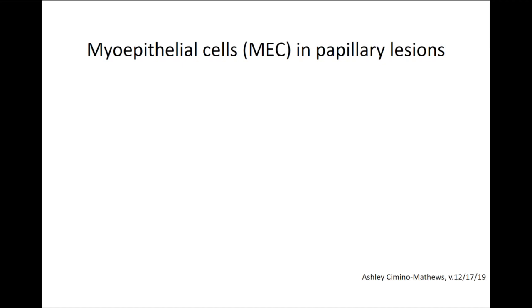So in this next hour or so, we'll take a look at papillary lesions of the breast. It's difficult to do papillary lesions in 60 minutes or less, but we'll cover most of the basics. And I want to start with a slide to give the underlying scaffold, if you will, to all of these lesions, and the way that I approach these in thinking about the distribution of the myoepithelial cells within the lesion. And I kind of keep these images in my mind as I take a slide and decide, okay, where on the spectrum of papillary lesions does this particular lesion fall?